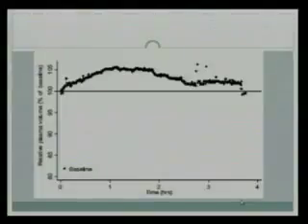So this is a patient, he was 42 years old, and he was a hemodialysis patient. His blood pressure was 150/90 on 4 antihypertensive medications. And this is the crit line of his dialysis treatment. So you can see he had a 4-hour treatment, and his line is completely flat. And a flat line basically indicates that the patient typically is volume overloaded and has more volume to give.